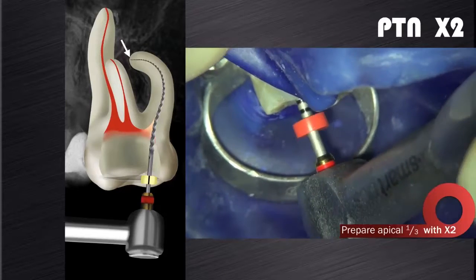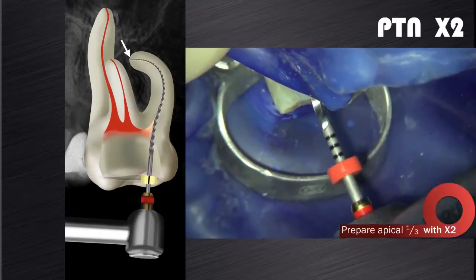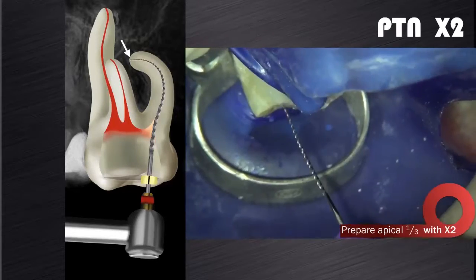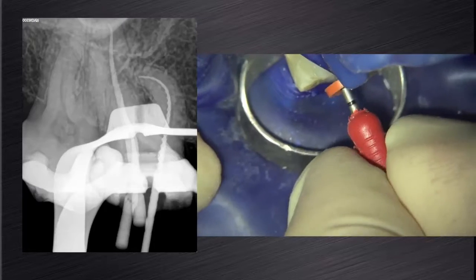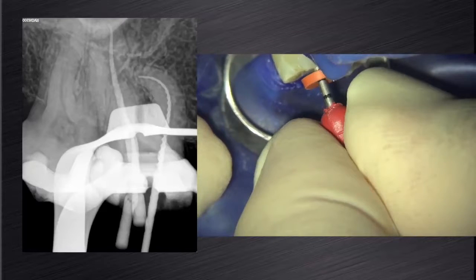We can now introduce ProTaper Next X2 again in a conventional way to prepare the apical third of the canal. We irrigate again and verify the canal shape with a size 25 Nitiflex hand file as we discussed previously. In this case, I decided to obturate this curved root canal system with GuttaCore, and on this video you could see the fit of the verifier.